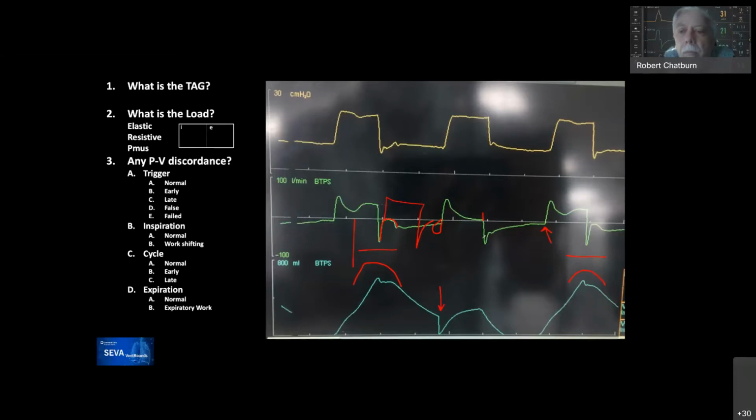All right, great. Wouldn't that comment only work if you're in a flow trigger mode? Like if you're pressure triggering, you'd have to bring the overall pressure down to PEEP and below. Yeah, which you can't do unless the flow goes through zero. Right. So it would only happen if you're flow triggering. At that point, you need to generate a differential to double trigger, but then it has to be outside the refractory window after the breath. A few milliseconds beyond that. Yeah, that's all true.